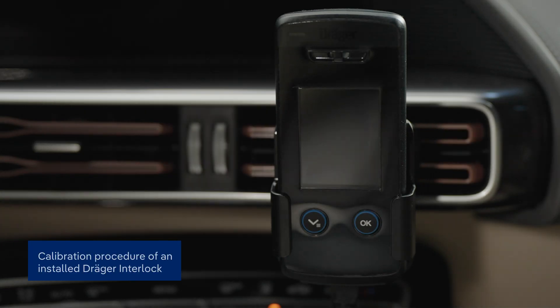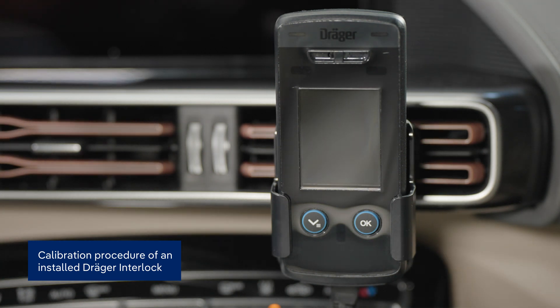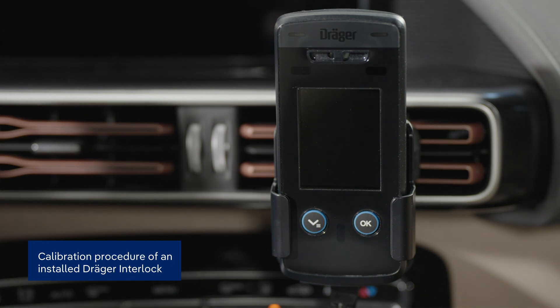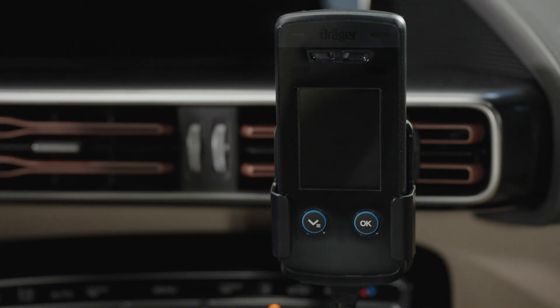To ensure consistently reliable and accurate readings over time, we recommend calibrating your Draeger Interlock once a year. In this video, we'll show you just how easy it is to do this.